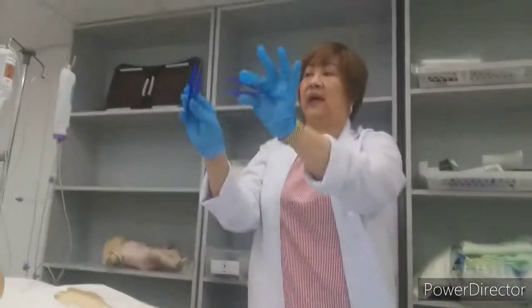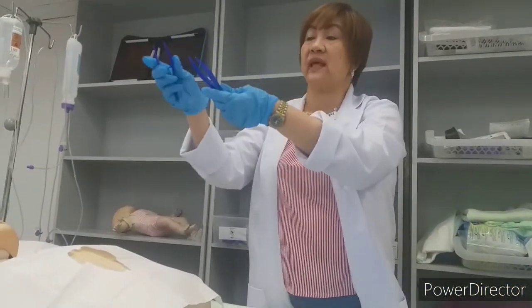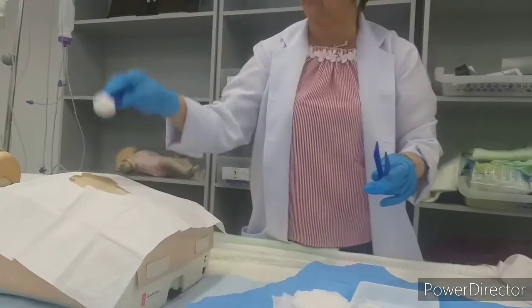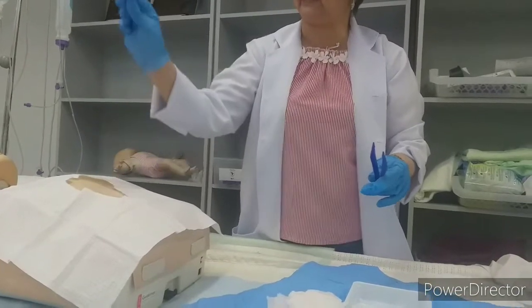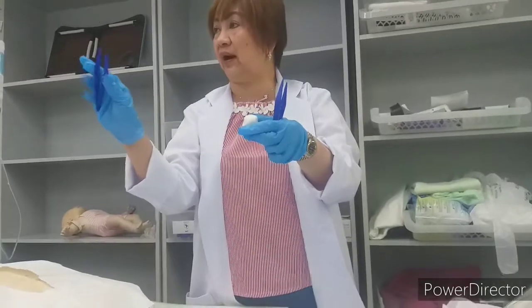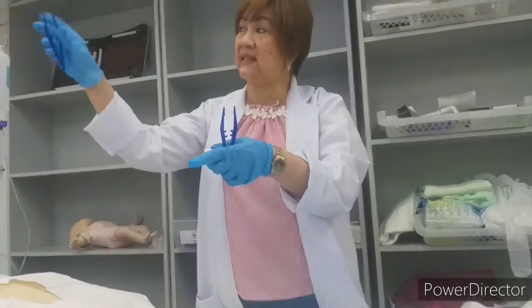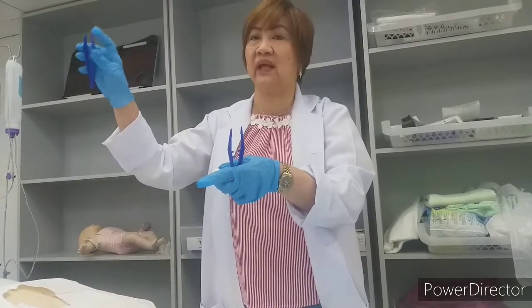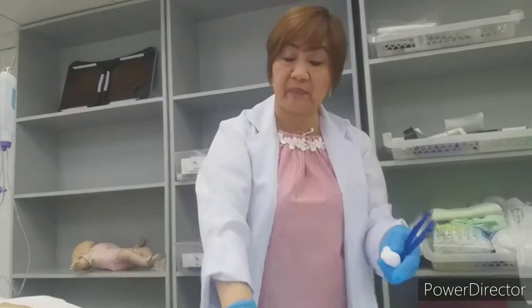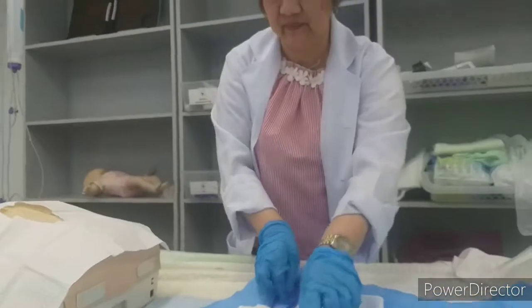We have, this is disposable thumb forceps. Thumb forceps, you can use this while doing your dressing if you are comfortable. But if not, because sometimes this one will slip, if you are not that comfortable, better use your glove. So this is non-tooth, there is no tooth here. If there is a tooth, maybe better because it will hold. Okay? Set it aside.